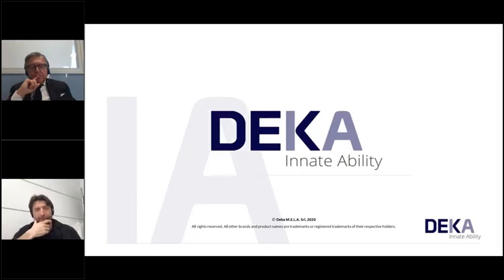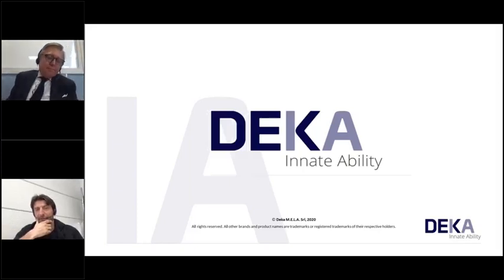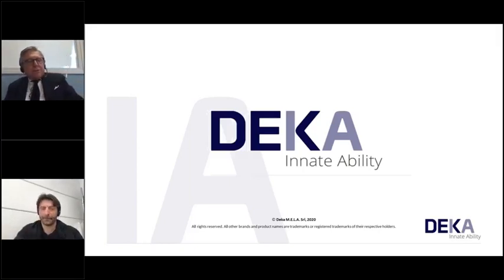Another question relates to the parameters used in the blepharoplasty procedure. Concerning the SmartXide DOT machine, do you have any recommendation or suggestion for using the continuous wave surgically in blepharoplasty? Well, I think that is a very important question for whom has the traditional, historical, fantastic SmartXide DOT, still fantastic. We have no particular features, but it remains one of the best in the market, even the previous one. My suggestion is please don't use continuous wave.